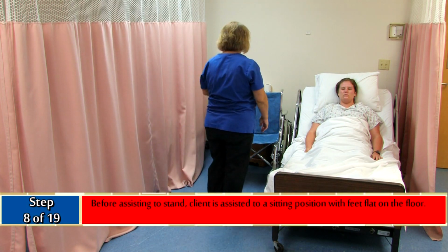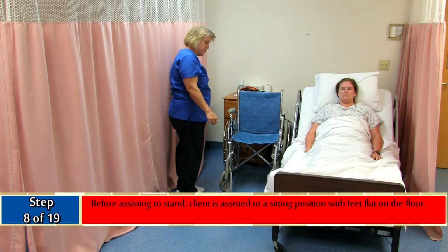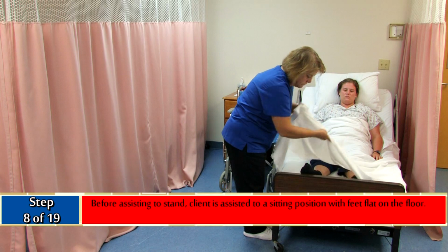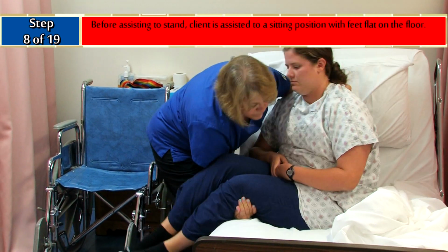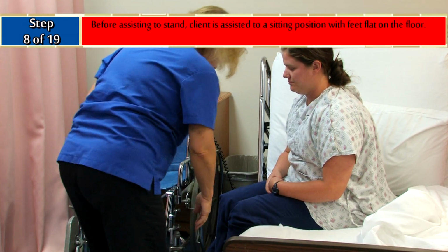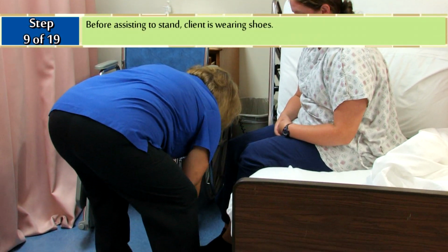Step 8 is a new critical element. Before assisting to stand, the client is assisted to a sitting position with feet flat on the floor. Before assisting to stand, the client is wearing shoes.